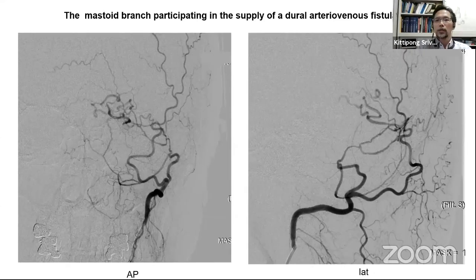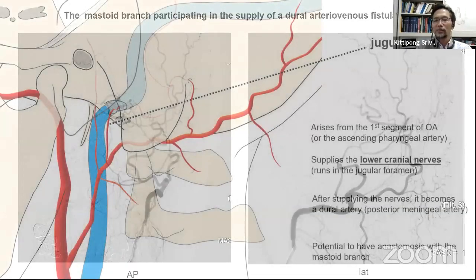Again, okay, the same thing. Turn here, give a superior trunk, the other inferior branch here, all going to the shunt. So it's just the same artery over and over. It's quite easy to recognize.